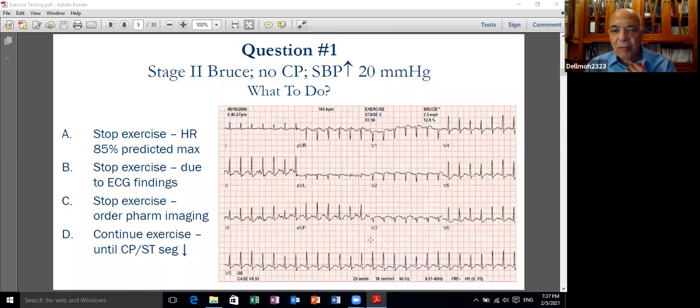So in addition, I will show you the previous electrocardiogram as well. You'll find pseudo-normalization of the T wave in the right precordial leads, but the ST elevation is very important to find. It has a localizing value.